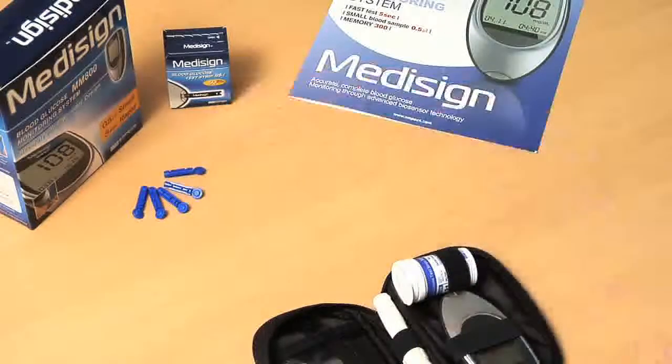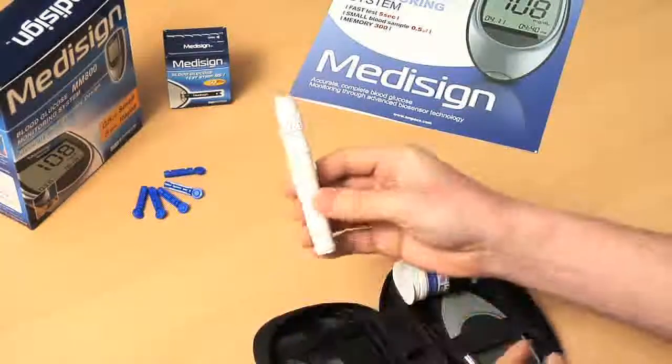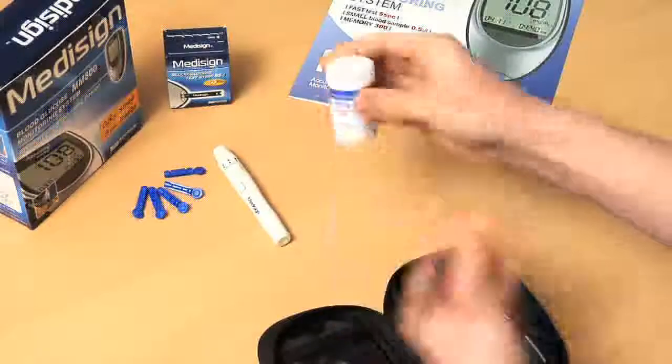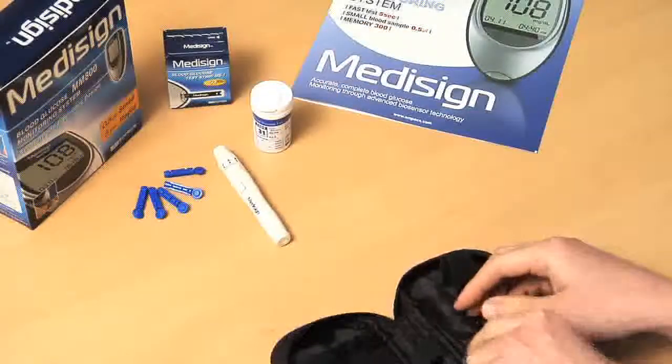MPEX Medical. The MediSign MM800 system consists of a lancet, lancing device, test strip, and a meter.